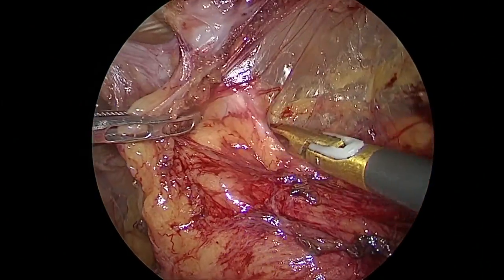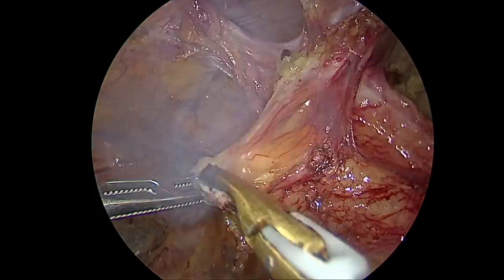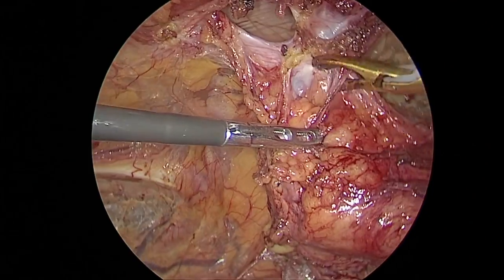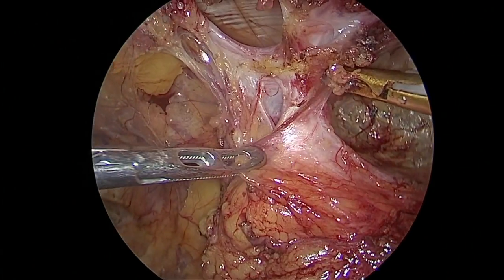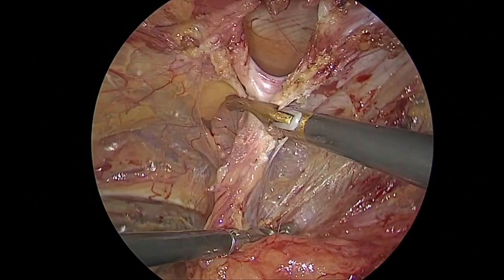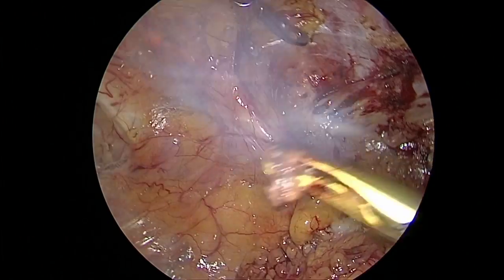So since I was having difficulty with the PRS, which was still adherent to the hernia on its superior aspect, after reduction of the sac, what I did was I lifted the whole of PRS onto the medial aspect, thus showing me the posterior approach to the Bogros space going towards the internal ring. So once that has been dissected, you can now go ahead and cut the PRS very confidently without the fear of damaging any underlying structures.